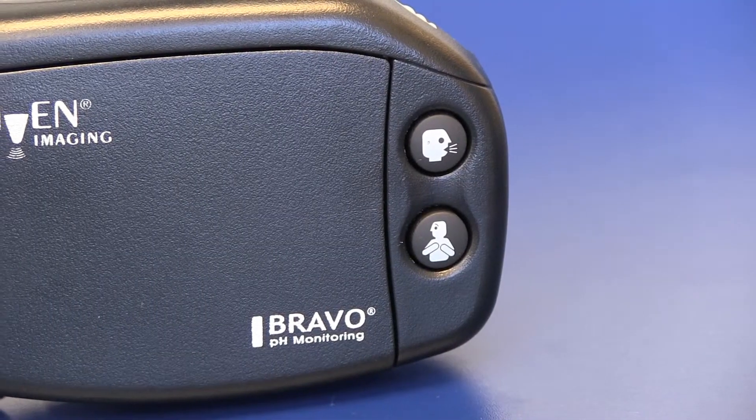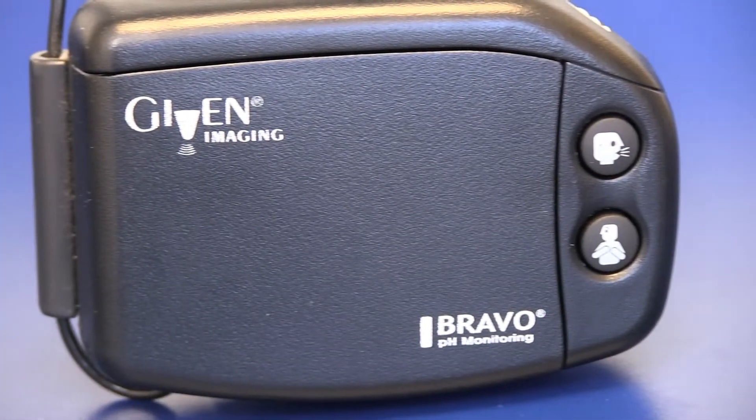The capsule begins measuring the PH levels of the esophagus immediately. The receiver houses three symptom buttons and you'll be asked to press the corresponding button when you experience heartburn, regurgitation, or chest pain during the procedure.